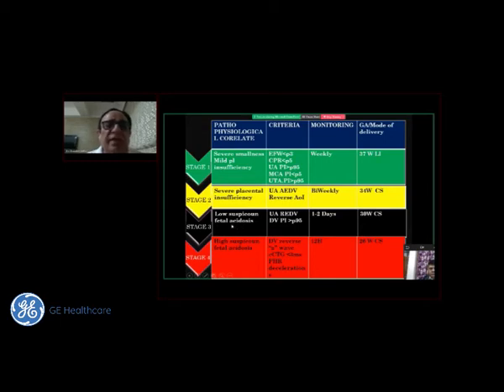Stage 3, there is fetal acidosis suspicion because you've got reversed end diastolic flow, and generally in both these stages we start getting a little worried, especially the obstetrician wants to remove the baby, and we know they have justifications. The babies sometimes don't do well. There is redistribution. Aortic isthmus shows redistribution, and we know that there are some papers which suggest that neurodevelopmental outcome is not good. So here again, the ductus venosus, as in the TRUFFLE study, is above the 95th centile. Intense monitoring, and we should not go beyond 30 weeks. We deliver at 30 weeks if this is worsening, as you can see here.